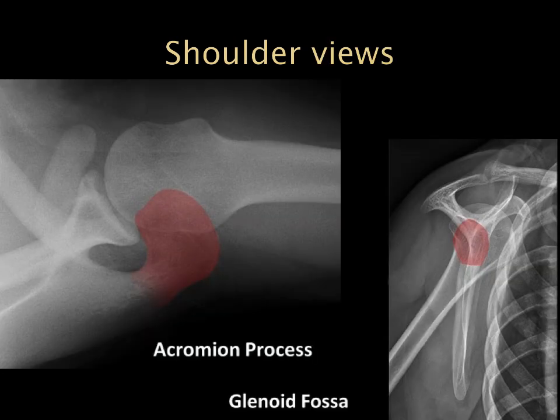Moving down to the shoulder, I want to highlight two views that might be a little confusing. The first is the axillary view, which gives us a good view of the glenohumeral joint, and also highlighted in red is the acromion — this view always gives us a good look at the acromion. The other view is the transcapular view, where we see a lot of overlap of different structures. Highlighted in red is the glenoid fossa, and when we're looking for dislocation, how does the humeral head relate to that glenoid fossa?